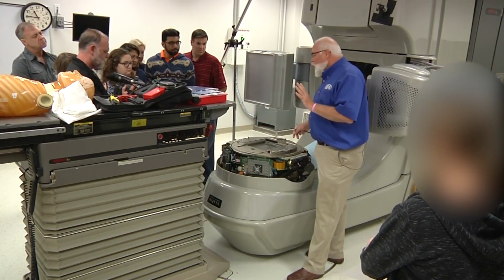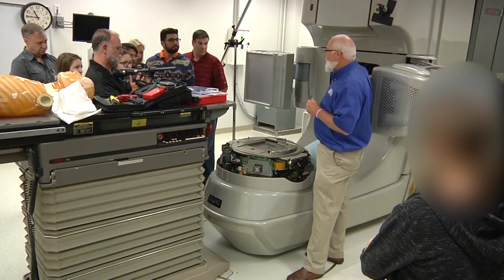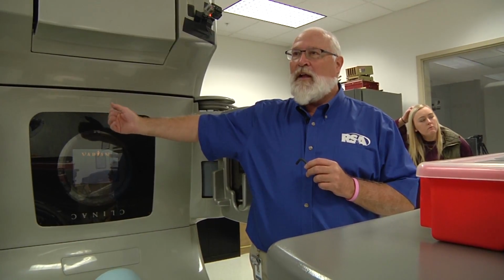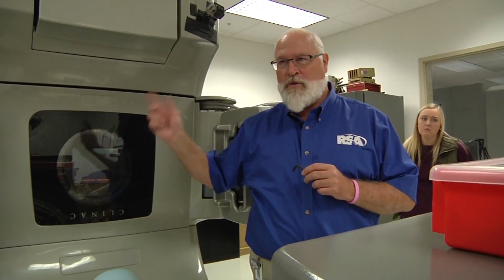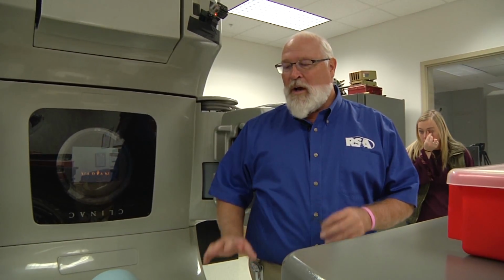So usually if I'm working with more than one person, I'll pin the gantry. What I mean when I pin the gantry is there's a mechanical pin that will slide in place and it locks the gantry in the 4 quadrants. So 90, 270, 0, head up, head down. So you can't rotate the gantry. Why that's important is because I'm going to take this cover off, and if you rotate the gantry, it'll slide off.